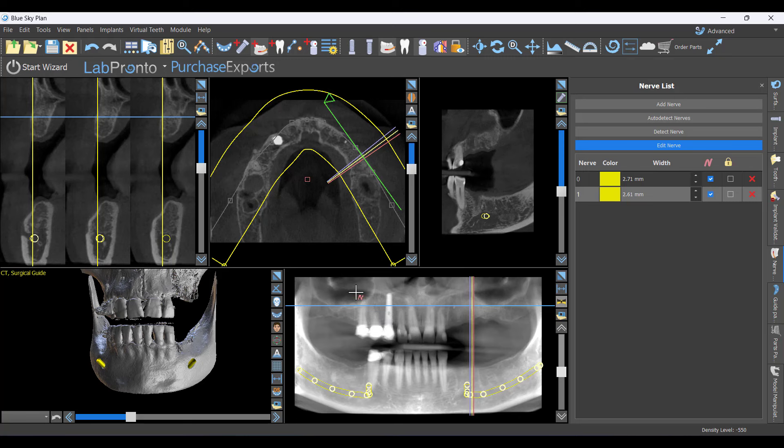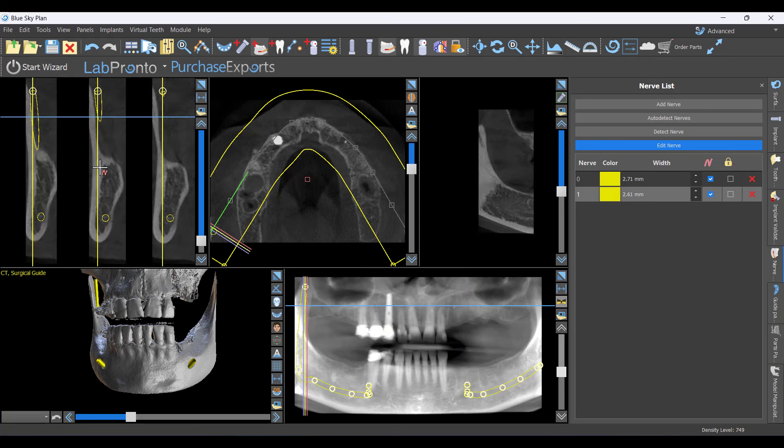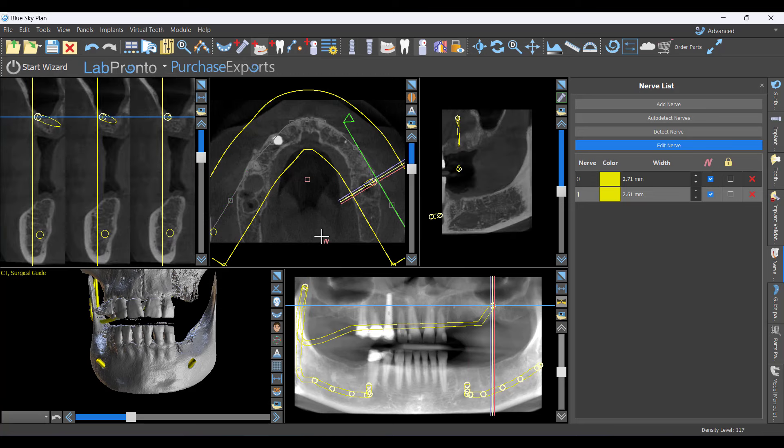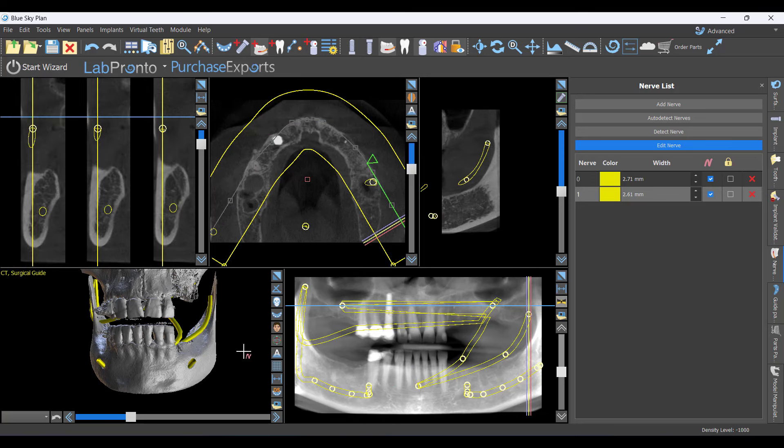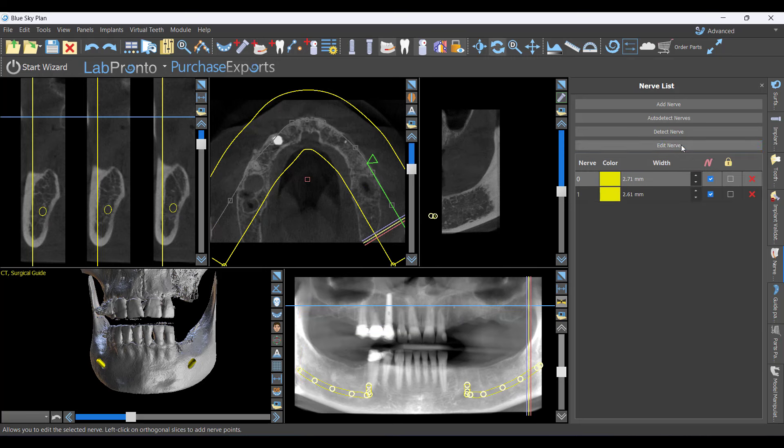In courses, people will just start clicking and wonder why nothing is behaving. Before long I come over and they've got a ball-of-yarn-looking thing because this tool stays active after you map the nerves — notice it's turned blue. You have to turn that off before doing anything else. Use the back arrow or Ctrl+Z to deactivate the tool.